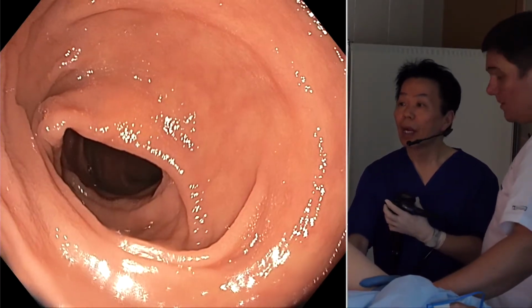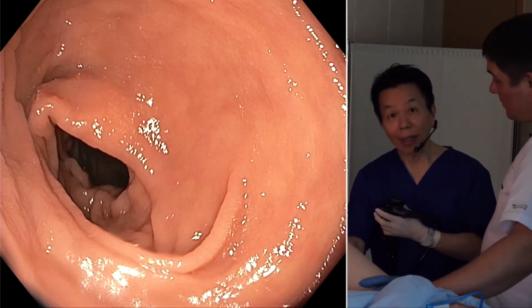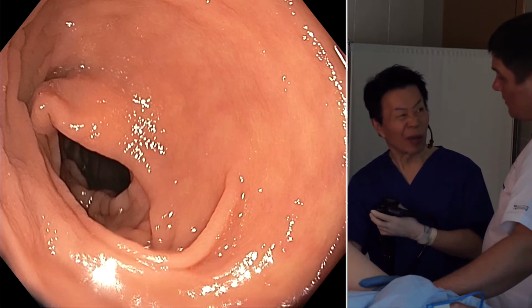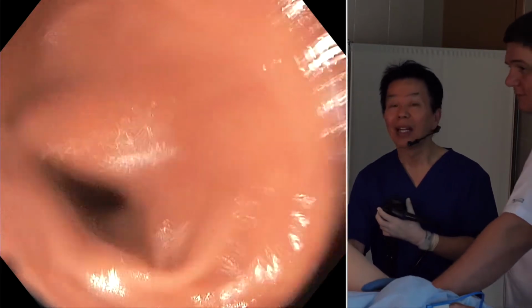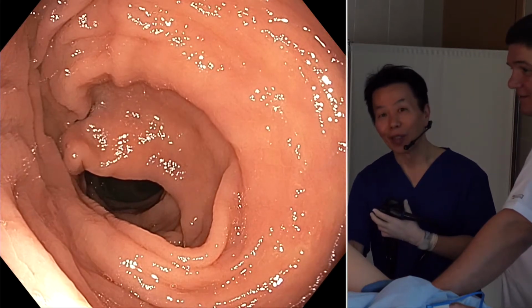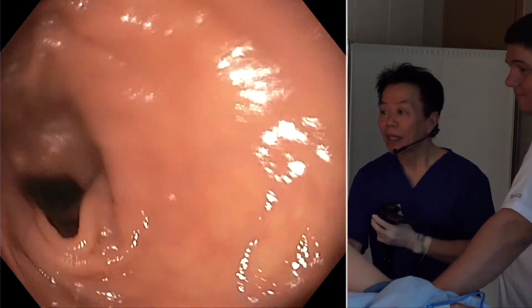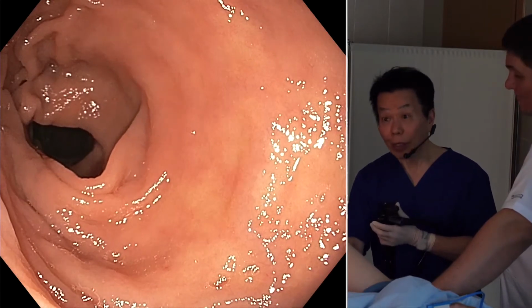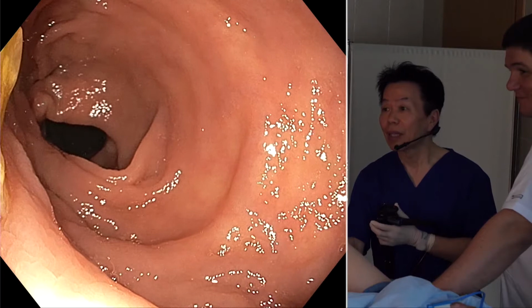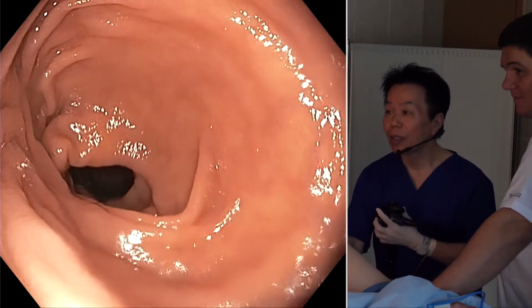It's okay. Retroflexion is very good, but sometimes it can cause perforation. Very rarely, but I have seen somebody cause a perforation during the retroflex view. Of course, you can use retroflexion, but instead of that, I inflate air or deflate air frequently.